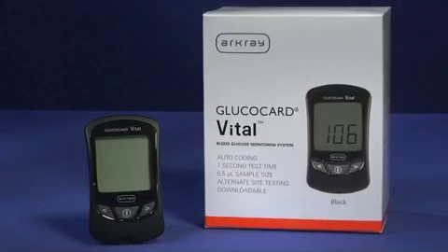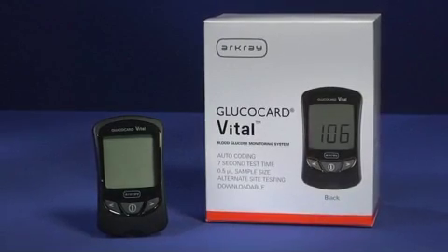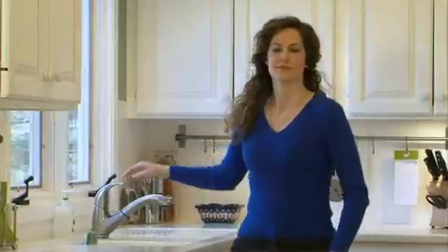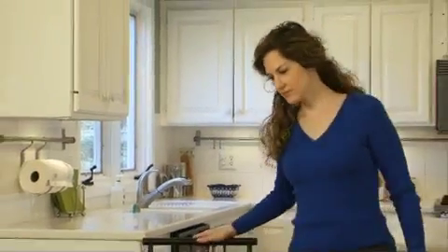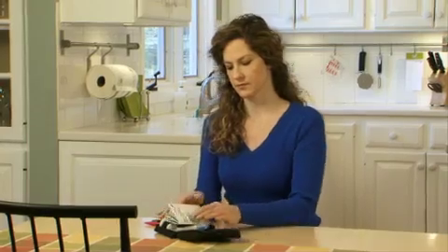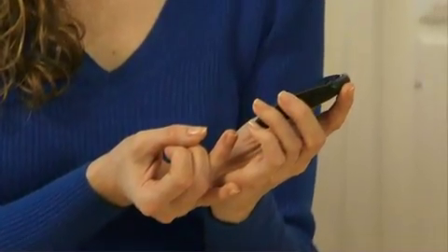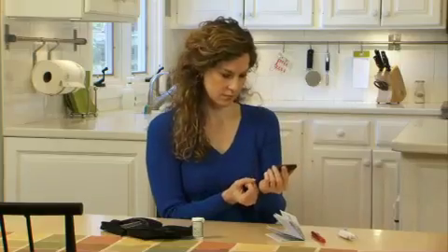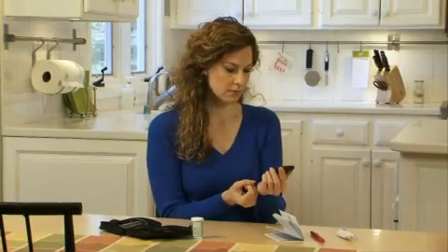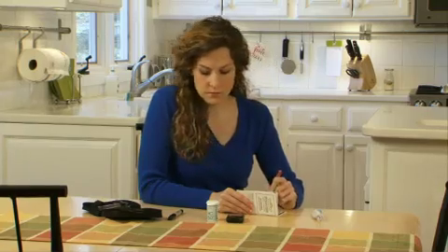Thank you for selecting the Glucocard Vital Blood Glucose Monitoring System. Frequent blood glucose testing is important — it tells you how your diabetes is affected by factors such as medication, diet, exercise, and stress management. Blood glucose test results can also tell you if your diabetes is changing in ways that affect your treatment plan. Always consult a health care professional before making any changes.